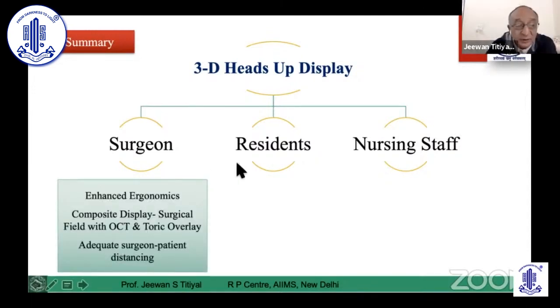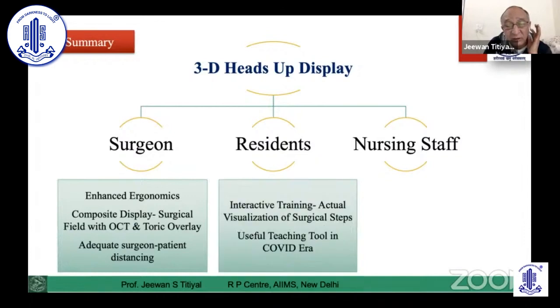With the enhanced ergonomics, especially the magnification, working with the OCT and toric image guided systems does help you in improving visual quality. Residents, I think, as Dr. Garewal talked about, it's very helpful for teaching.